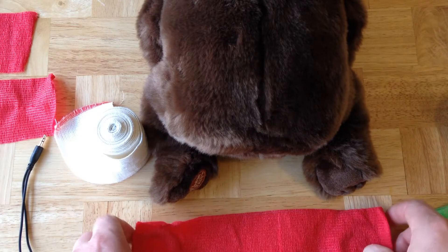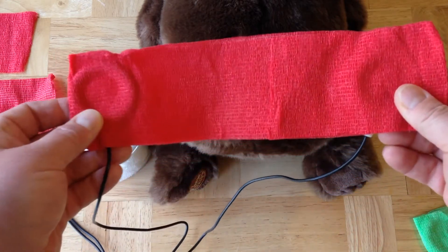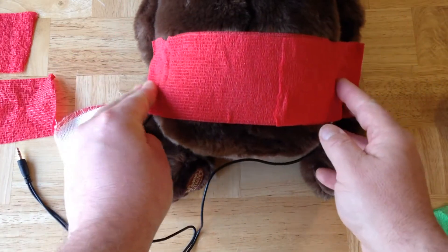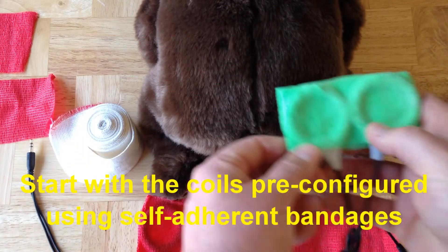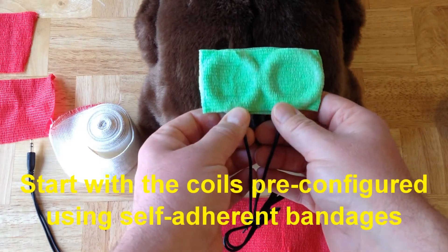First, you use a length of self-adhering elastic wrap to hold the coils into their configuration. In this case, this was set up in an earlier video to hold the coils on opposite sides of the hips, always making sure that the bumps are facing out. As another example, this configuration shows two coils placed permanently in side-by-side configuration.